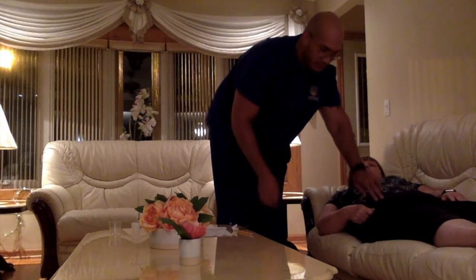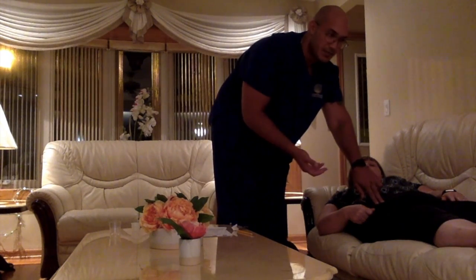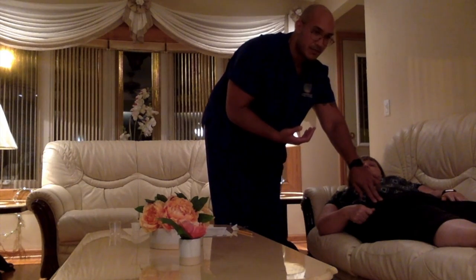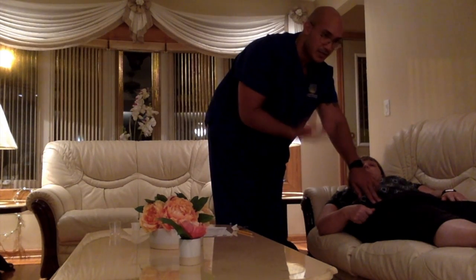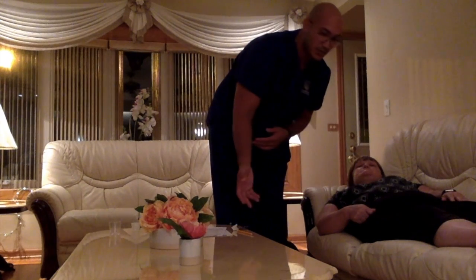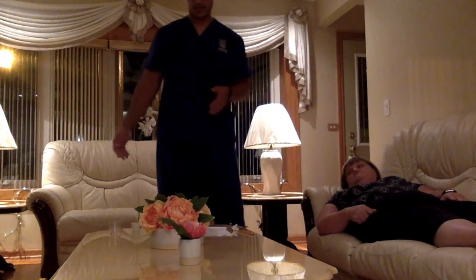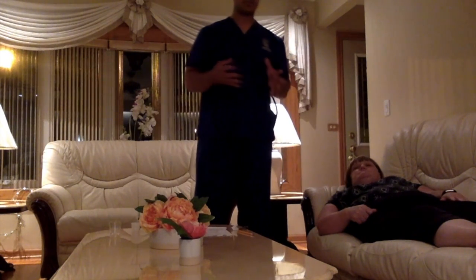Then I would put a cotton swab there. If there's any bleeding, have the patient keep pressure on there. And then after I'm done discarding the syringe, I would then put on a Band-Aid if bleeding continues. And that is all for the medication administration video.